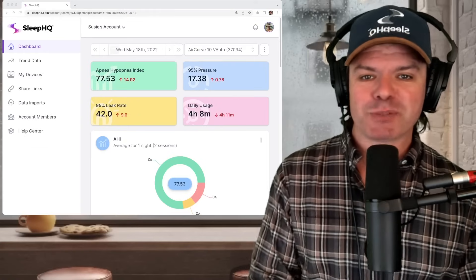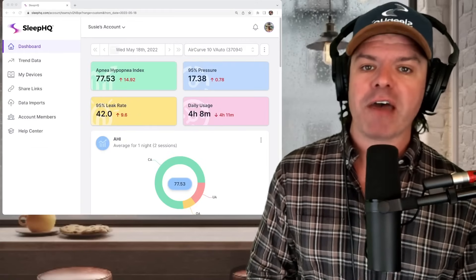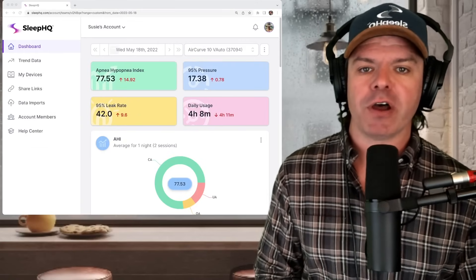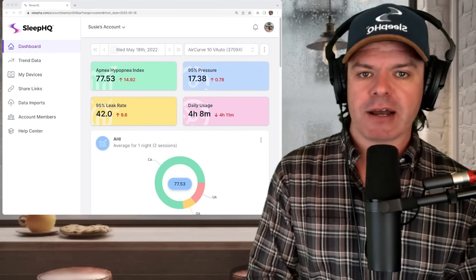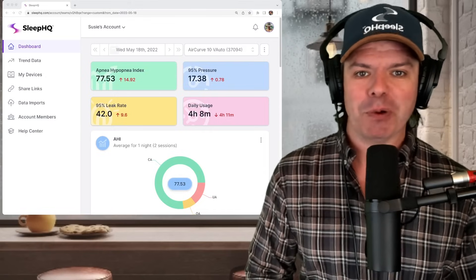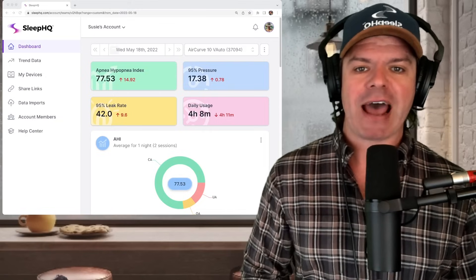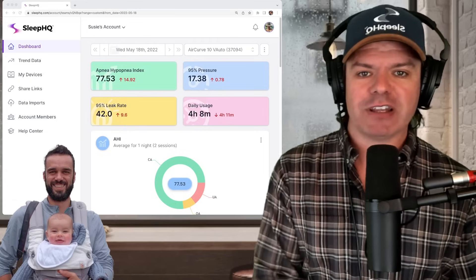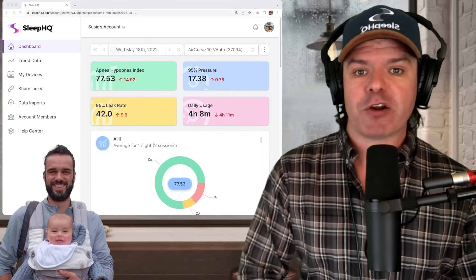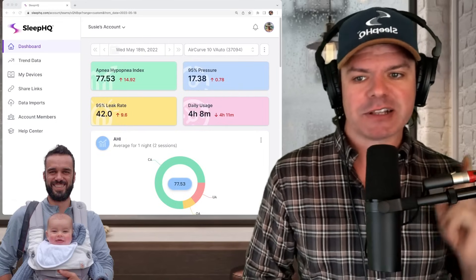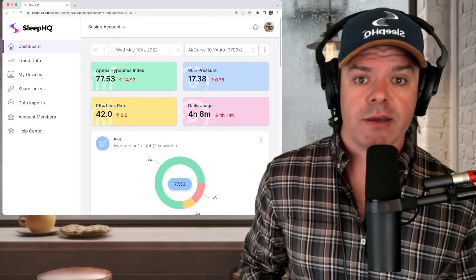So here we are on the dashboard at SleepHQ.com. And for those that don't know, this is my CPAP data analysis platform that I built with my best mate Adam, and it's free. So if you'd like to use it to analyze your CPAP therapy, just click the link above. Crikey.